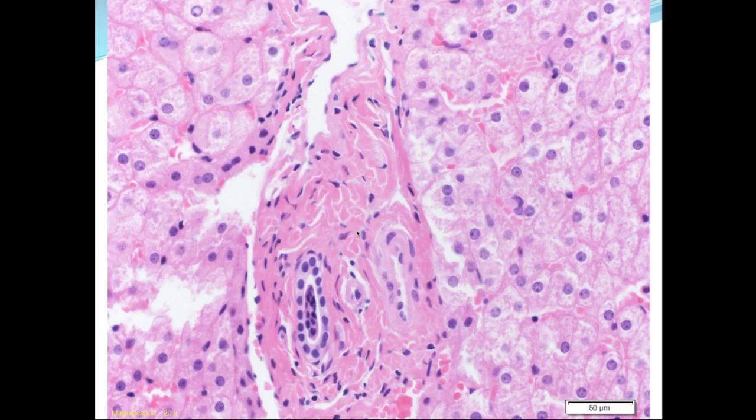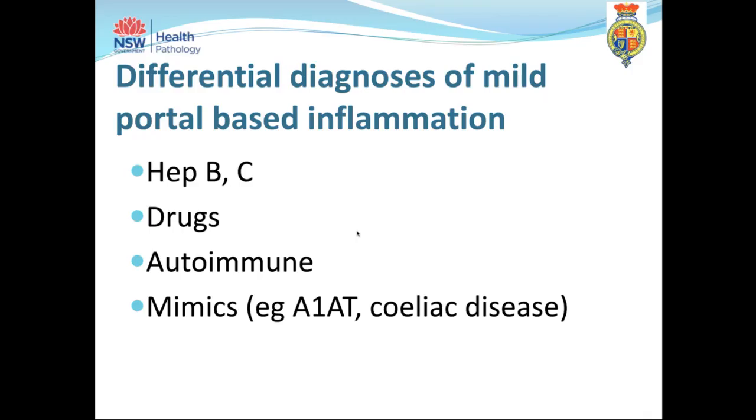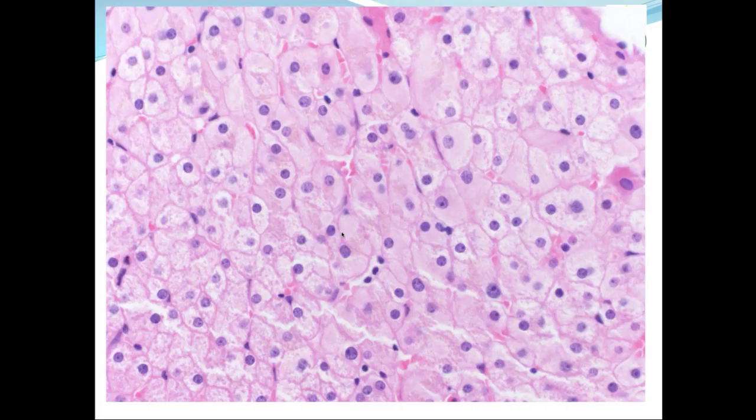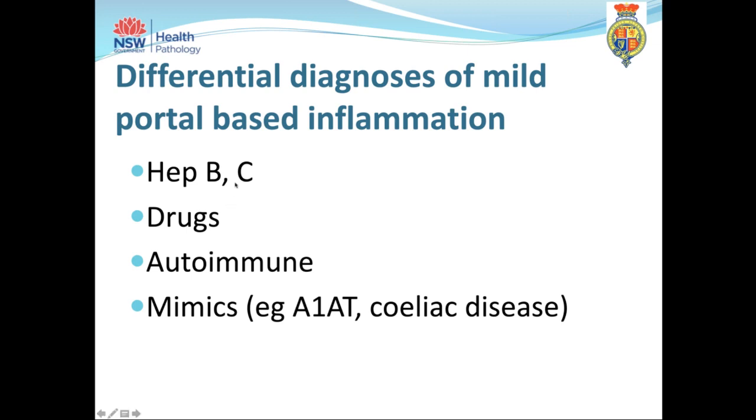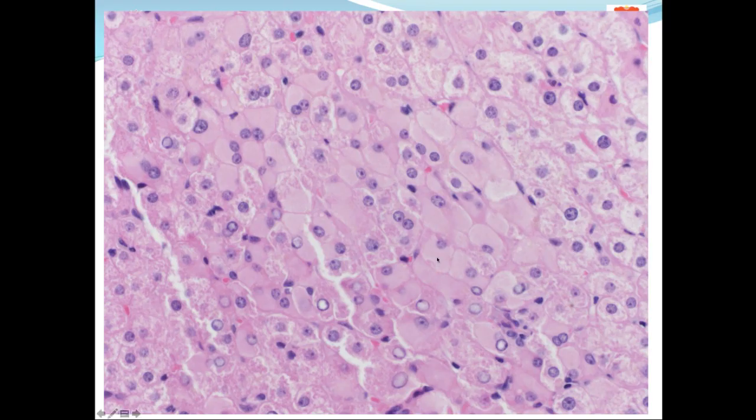Looking more closely at this case in the portal tract region, some looked quite normal, but some did contain a mild chronic inflammatory cell infiltrate, which brings me to my first checkpoint list, the things you should think about with mild portal inflammation, which include hepatitis B and C, drugs, autoimmune, and some mimics of chronic hepatitis that I'll touch on later. Looking more closely in the hepatic parenchyma, you can see that the hepatocytes, in fact, have this quite nice ground glass change.